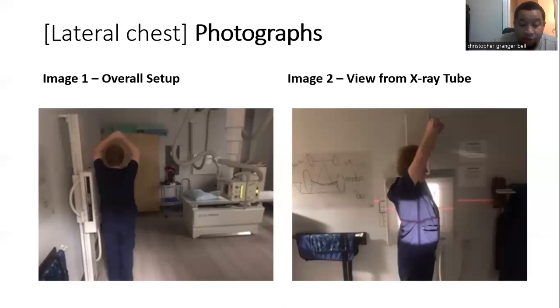The anatomy demonstrated was the entire lung from the apices to the costophrenic angles and from the sternum anteriorly to the posterior ribs and the thorax posteriorly. The items in profile are the entire lungs from the apices to the costophrenic angles. The pathology best demonstrated is the retrosternal and retrocardiac air spaces, as well as any fractures to the ribs that are in view.